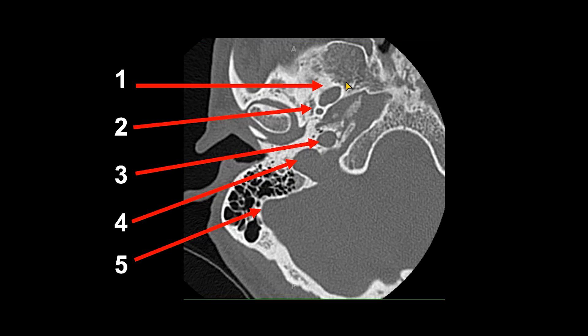Number three is the carotid canal. We're just at the level of the foramen lacerum, where the petrous portion of the internal carotid artery runs over top of it. Number four is the jugular foramen, where the jugular vein is transmitted along with cranial nerves 9, 10, and 11 in the pars nervosa and pars vascularis. Number five shows the sigmoid sinus junction with the transverse sinus; some people refer to the overlying bone as the sigmoid plate.